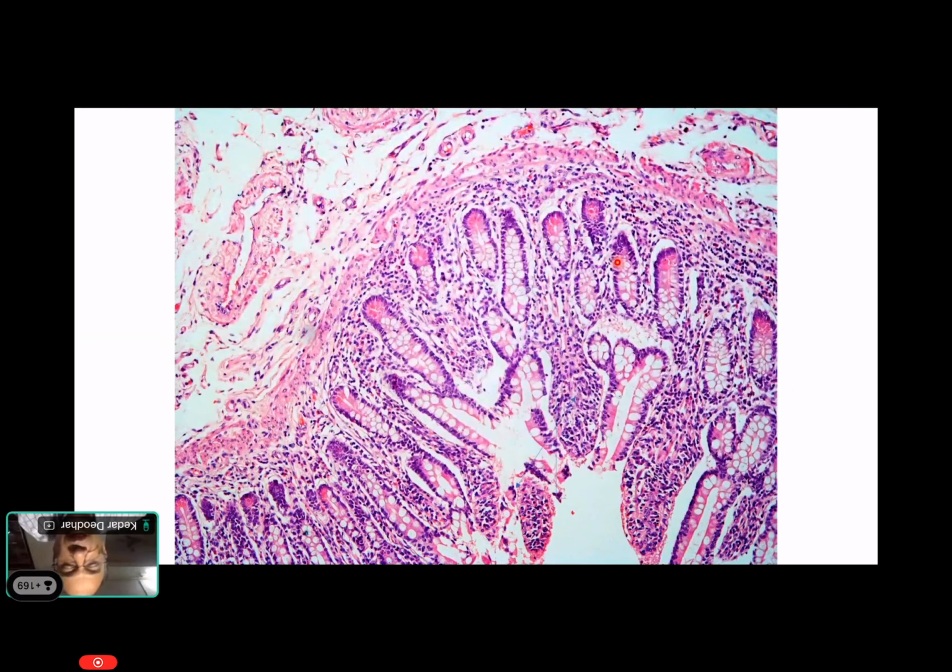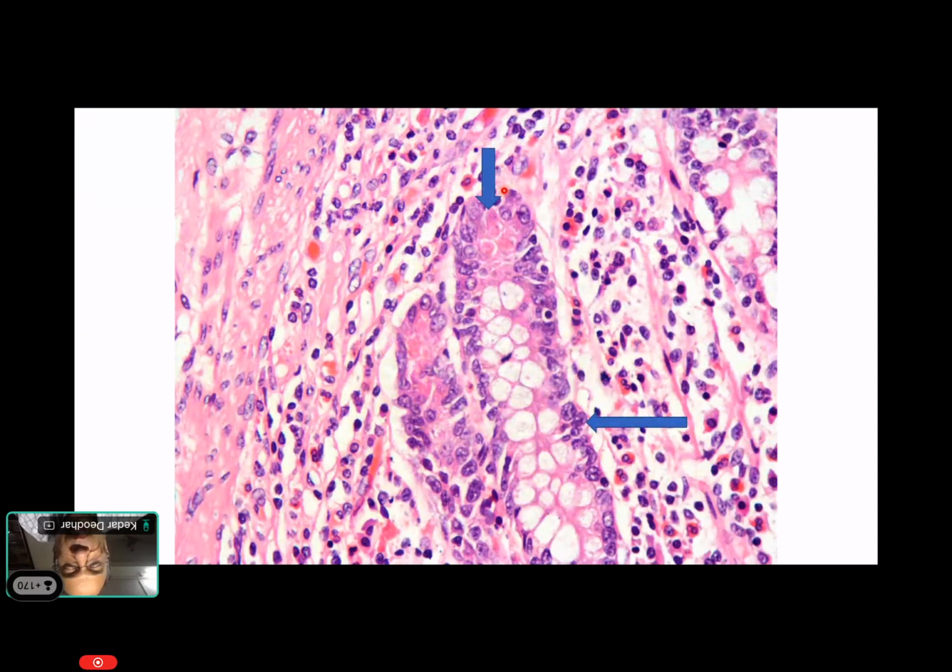We also have endocrine cells, which have infranuclear small granules, and they are finer granules. These are part of the crypts of Lieberkühn. So these are the examples of the crypts of Lieberkühn. If you go to a higher level, these are the cells. We have nuclei basally, and we have suprabasal coarse granules. These are the Paneth cells, and maybe these are the endocrine cells which are part of the crypts. Endocrine cells usually will have very fine eosinophilic granules in the lower part of the cytoplasm.